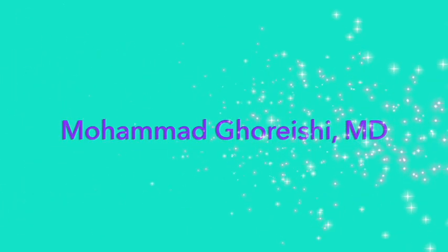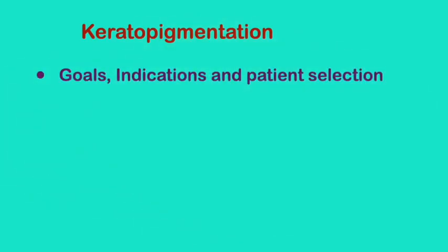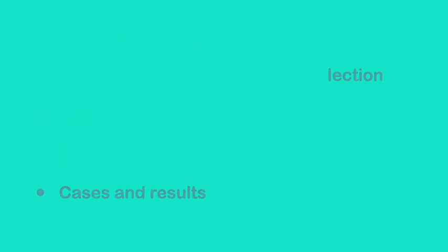Keratopigmentation. In this video, the following subjects will be presented and discussed: goals, indications and patient selection, surgical techniques, pigments and properties, cases and results.